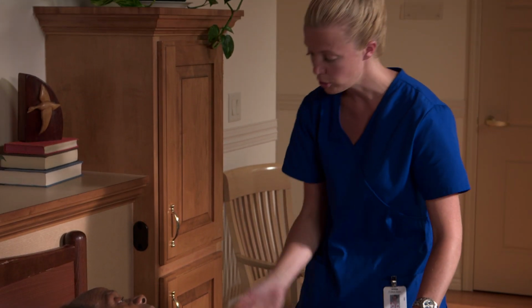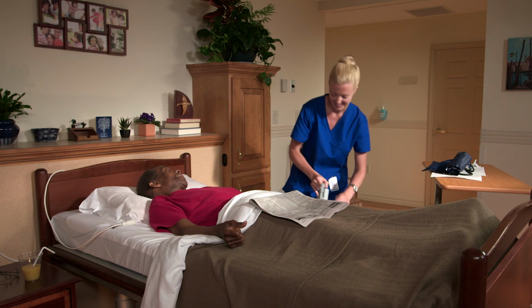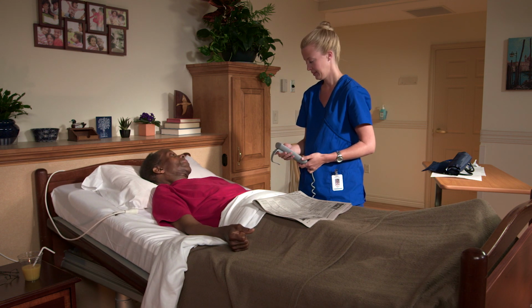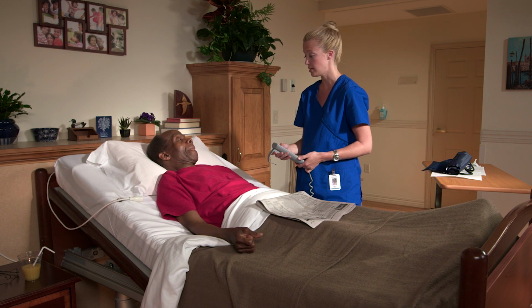There you go. Would you like the head of your bed raised again? Yes, I would. Okay. Clean up your work area, wash your hands, and report and record. Is that feeling all right? It's feeling good. Good. You tell me when to stop, okay? Okay.